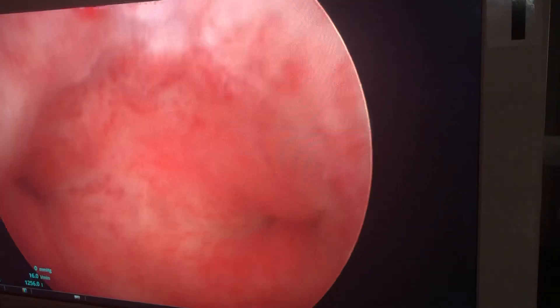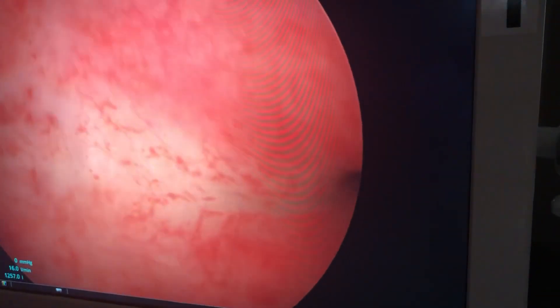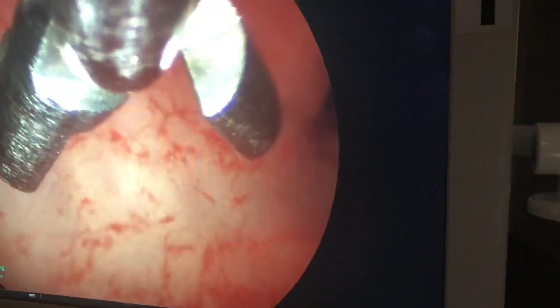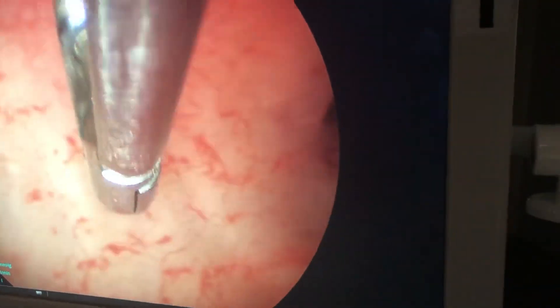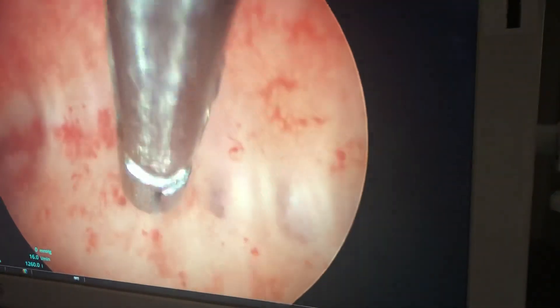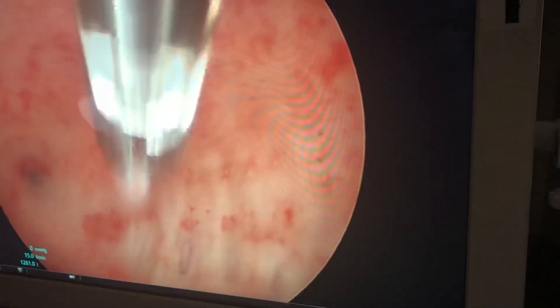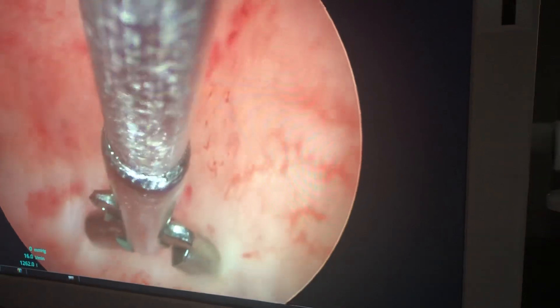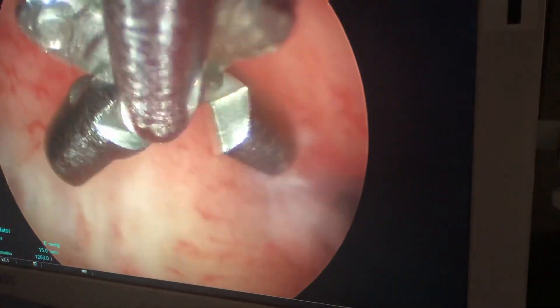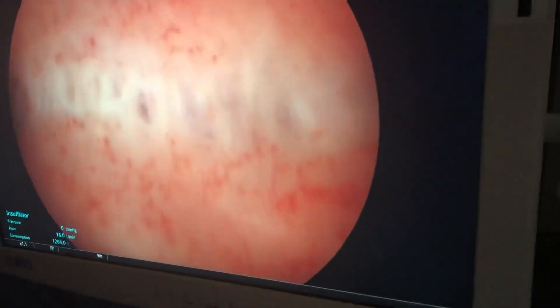There's the entire cavity. It's not very obvious to you because this is in two dimensions, but in three dimensions this area right here in the uterus is coming towards us. And I can see that it is white and fibrous. Now I'm going to remove some of the superficial tissue to give me a line that I'll be able to aim for. You can see these white fibrous bands going up and down and they do not have good blood supply — these are avascular. As you can see there's no bleeding as I'm scraping off the top, and I'm beginning to see these white fibrous bands that are the septum.